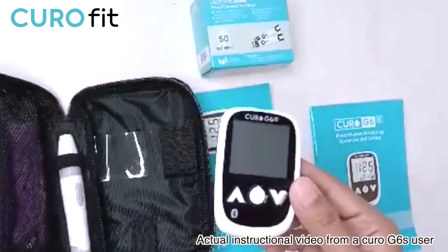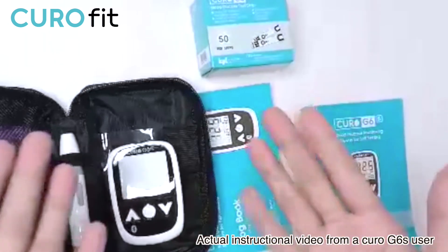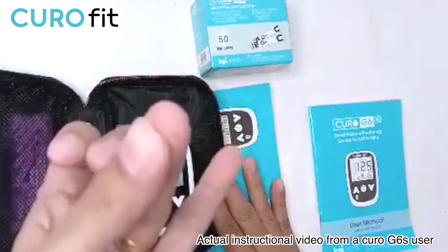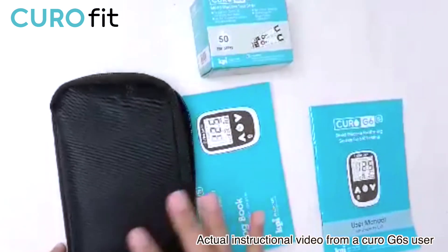The very first thing we need to do before testing blood sugar is to wash our hands with warm water and mild soap. Warm water also helps increase the blood flow to our fingertips. After washing your hands, make sure that your hands are thoroughly dry before starting the test.